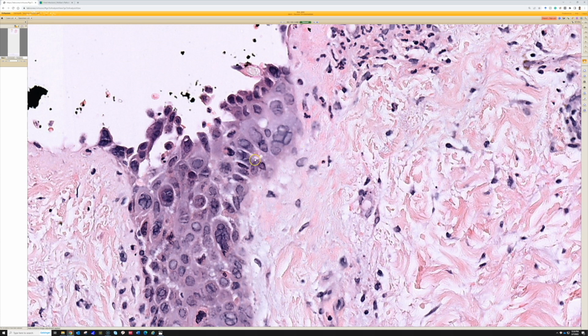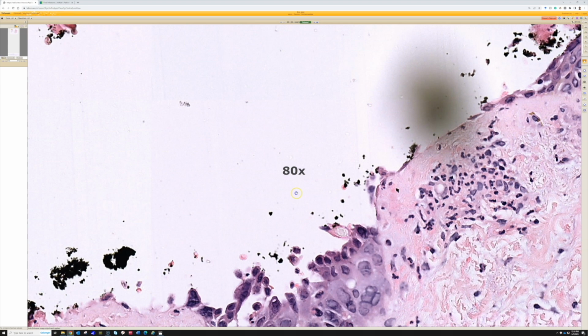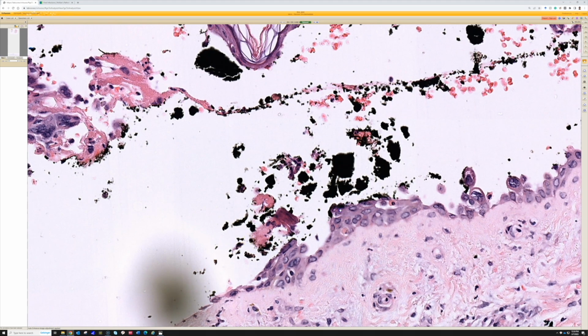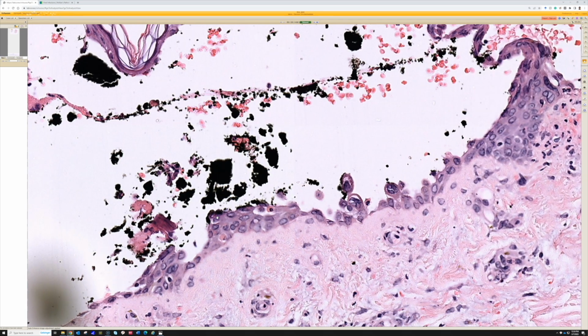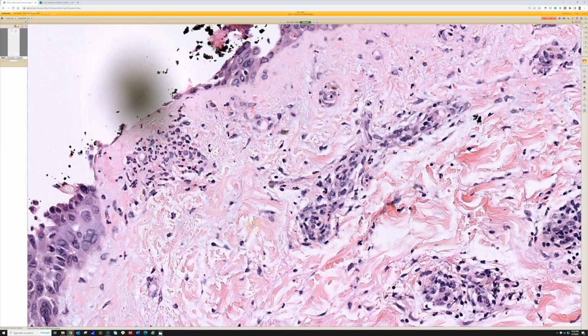Sometimes they're really perfect, like here. Other times you kind of hallucinate them a little bit in the dead and dying keratinocytes in the center of the blister cavity. And that's especially true when there's a lot of necrosis, a lot of inflammation and neutrophils, which is actually, I would say, more often than not what I see in herpes. I see this really inflamed necrotic ulcer. Maybe the blister is not even visible anymore because of how much necrosis and inflammation there is. So look at the adnexal structures to try to find the best viral cytopathic effect.